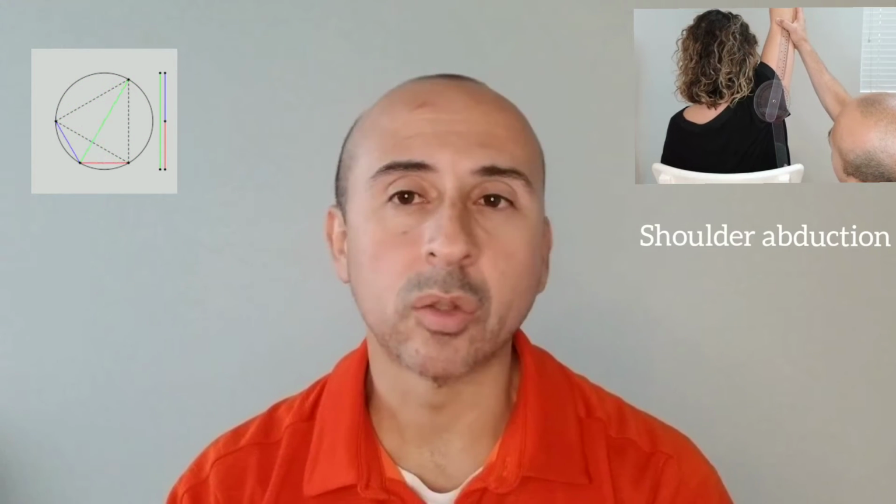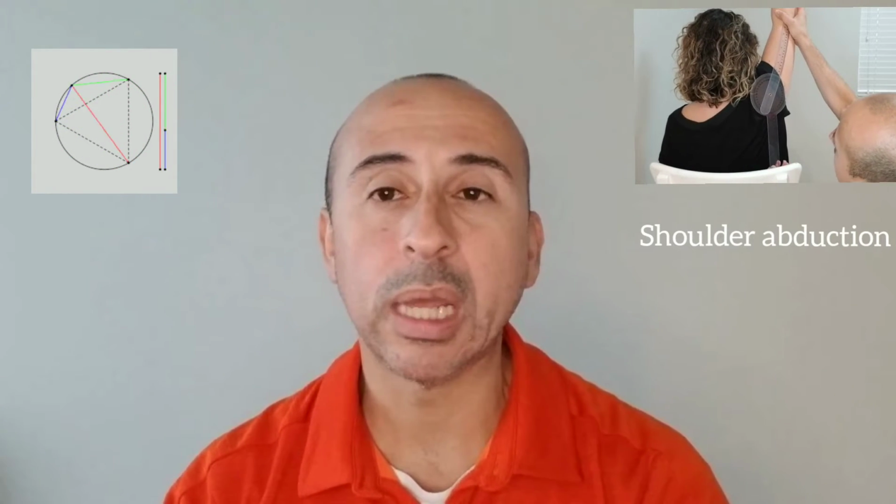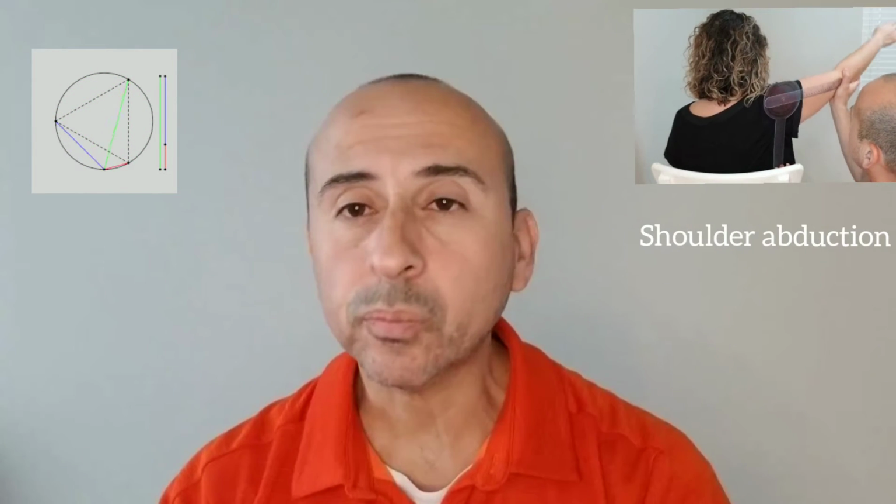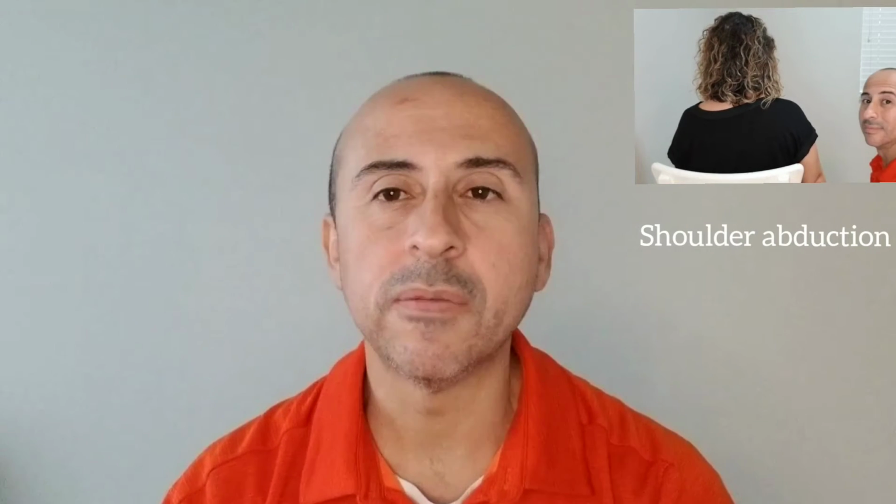Degrees of movement, as long as you have your true axis point and you're having a good starting position, your stationary arm is where it needs to be, the degrees of motion are going to be fine. To improve inter-rater results and to get the most accurate results, you want to make sure you stick to the textbook and try to get that position in the optimal situation.